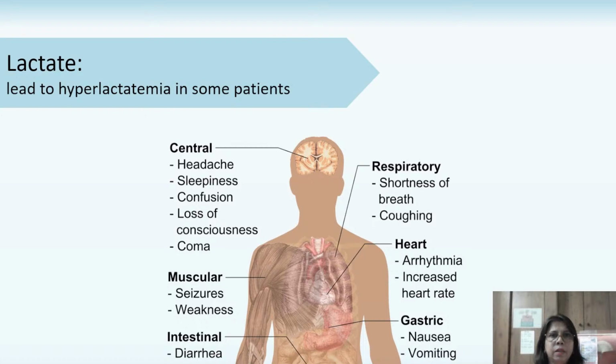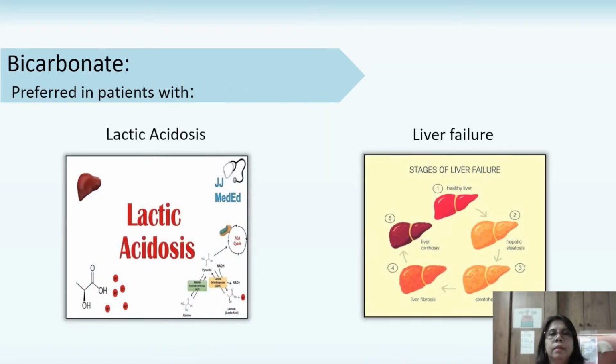When lactate is used as a buffer, the high levels of lactate in the blood may be clinically misinterpreted, whether this is physiological or whether it is because of the lactate buffer being used. Hyperlactatemia confuses and causes concern because it may lead to increased urea generation, it may lead to hemodynamic instability, and it may lead to cerebral dysfunction. And so, lactate is not preferred. Hyperlactatemia may also develop in situations where lactate buffer is used with high volume hemofiltration.